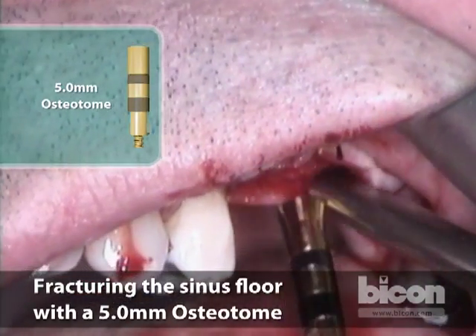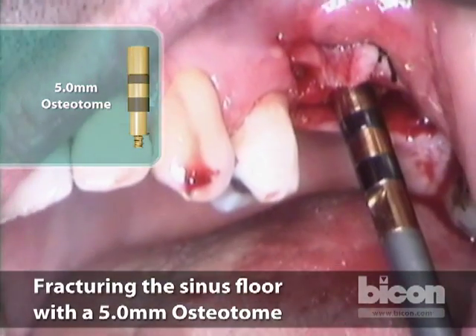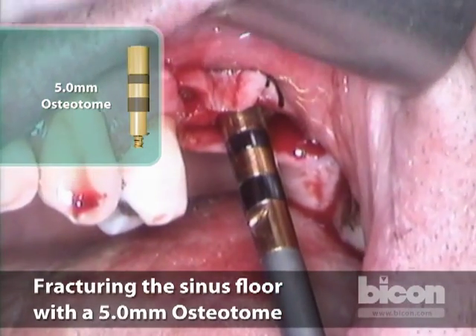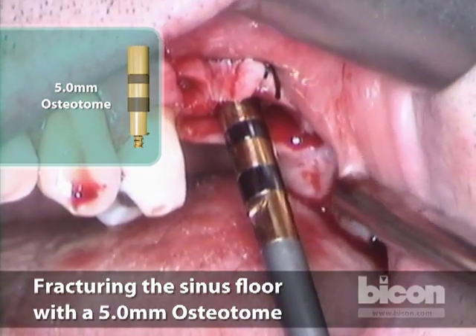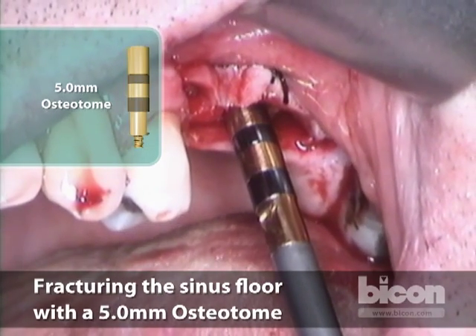The reason for having this kind of flare at the top is because I can enter the osteotomy and then angle it. I know that the mesial part of the osteotomy has to be thicker, so I will hit it harder with a little bit of tapping.